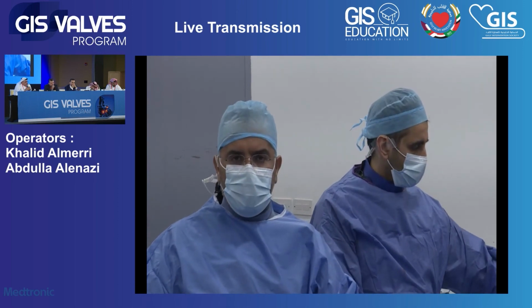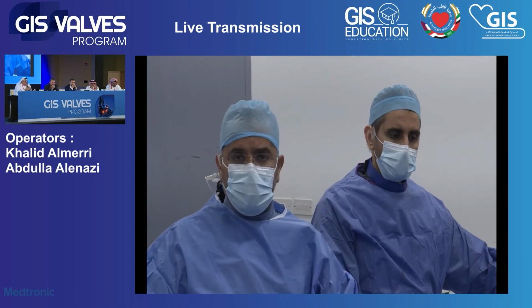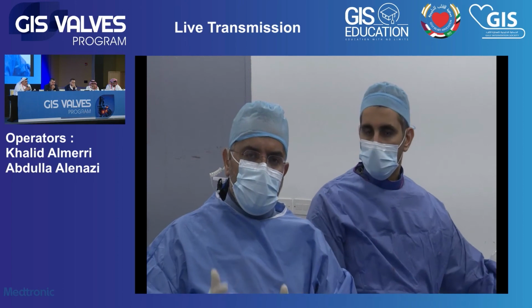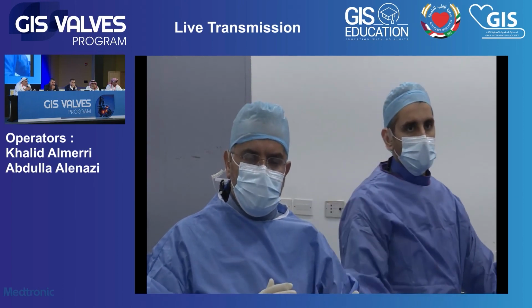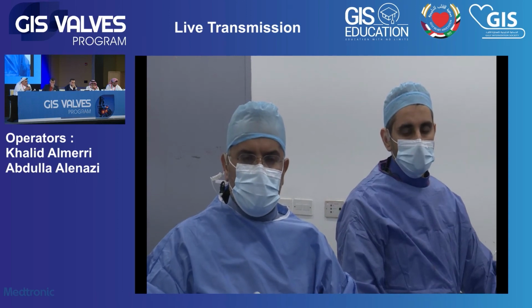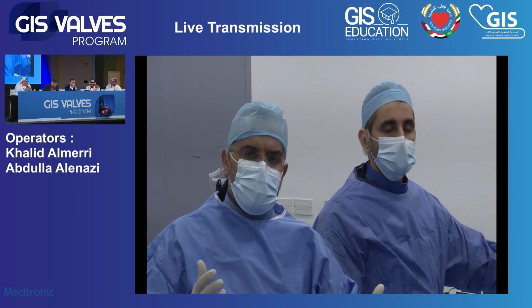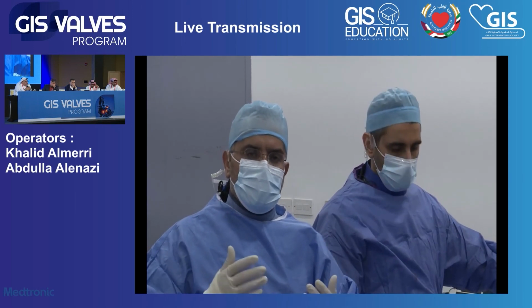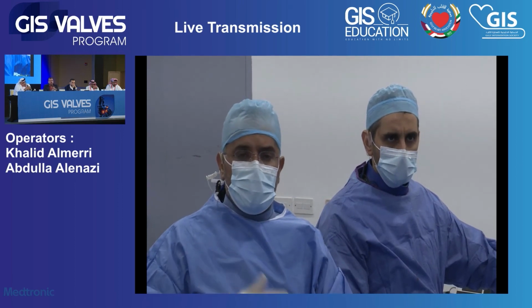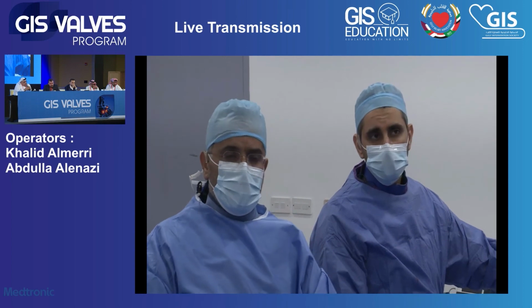Whether this is a mechanical valve or non-mechanical valve, when you cross the valve, you have to make sure that your wire is not interacting with the mitral apparatus. So once you cross, you go to the area of projection and go with a pigtail and make sure that it's free, it's not interacting with the valve. And this applies to the mechanical valve too. You have to be sure about your position. Yes, the wire can go between the discs. Things can happen that way if you're not careful.